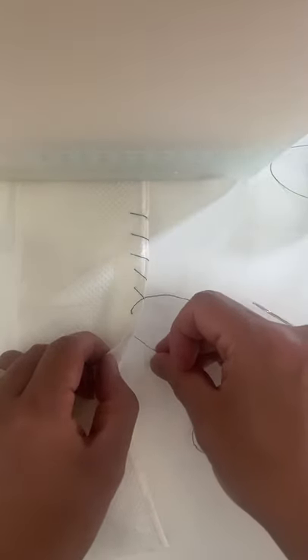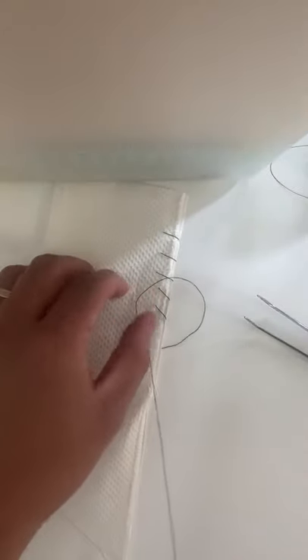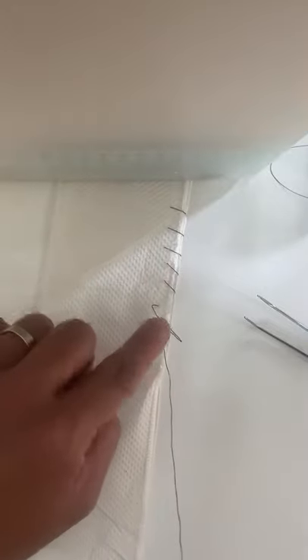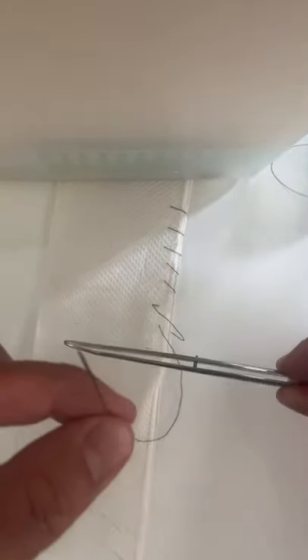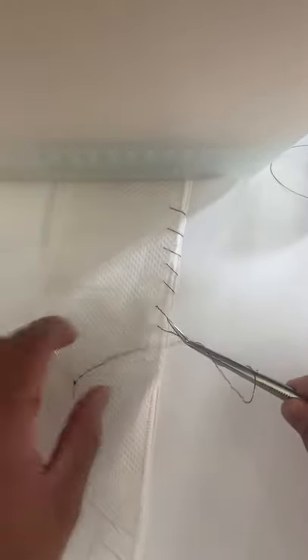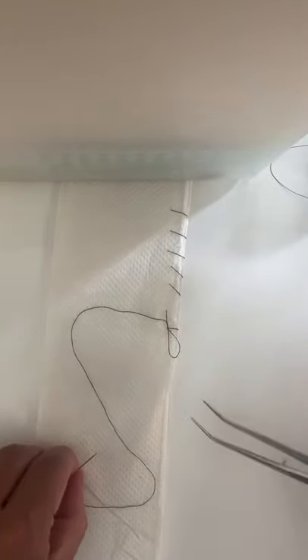And now we're going to close it off. The trick to closing this off is we're going to do our last stitch here, then pull until we leave a little bit of a loop that we can grab. So I'm pulling through — this loop is my reference point. I'm going to go the same technique: go forward once, twice, grab this loop, and pull through. Then once, twice more, grab the loop, and pull through.